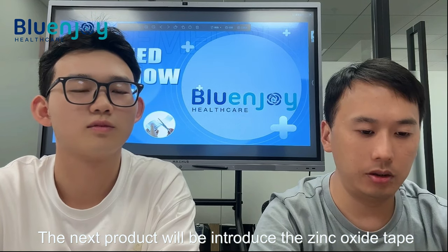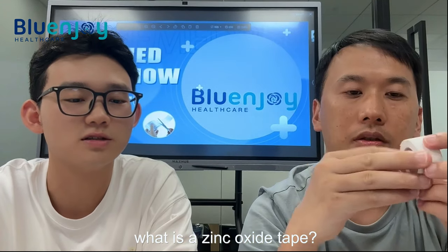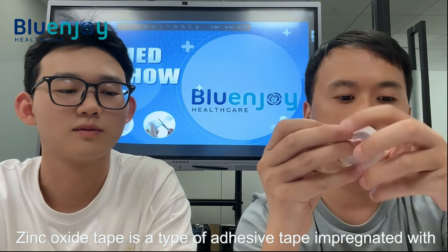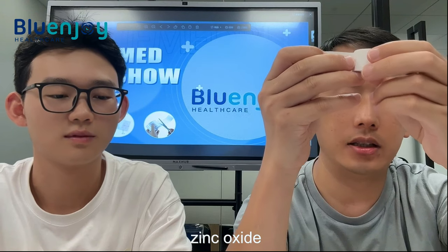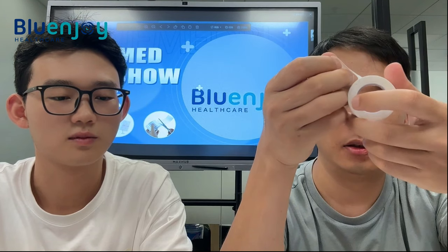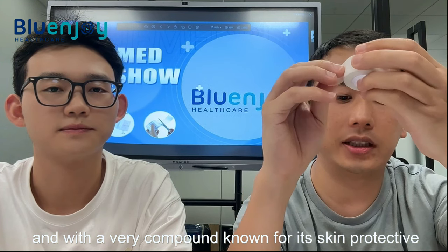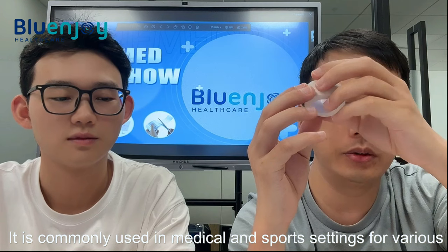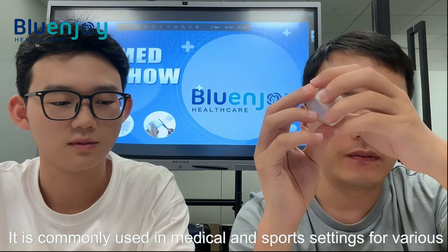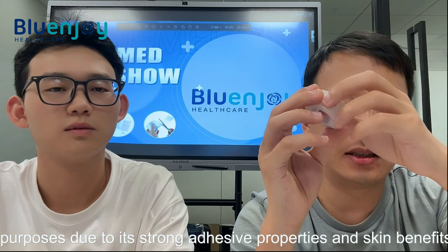The next product will be a zinc oxide tape. Zinc oxide tape is a type of adhesive tape impregnated with zinc oxide. It is very conformable, skin protective, and has antiseptic properties. It is commonly used in medical and sports settings for various purposes due to its strong adhesive properties and skin benefits.